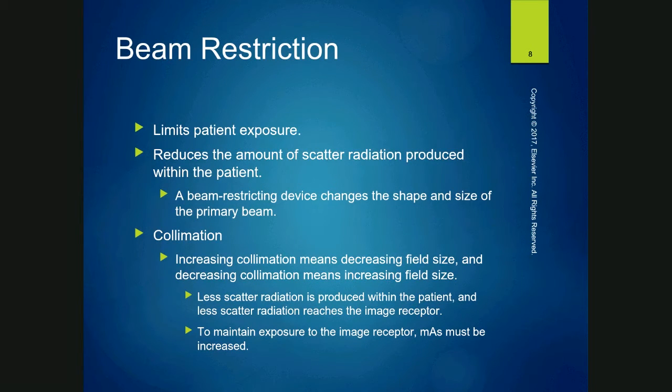It's going to reduce your patient exposure. I'll talk about that in a minute. Your patient exposure is going to be reduced because you're physically not putting x-rays on as much area.